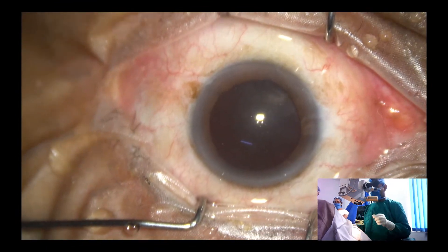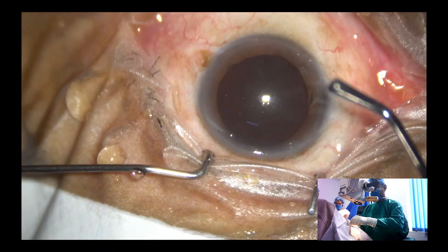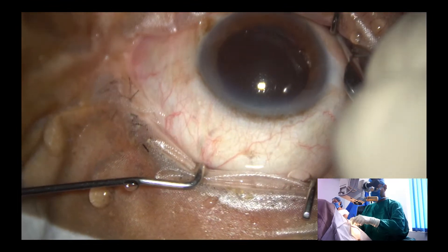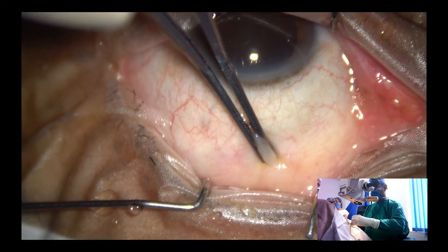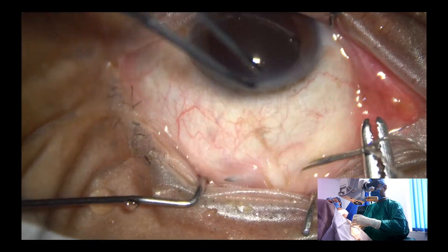First, I am going to apply a superior rectus bridle suture. The eyeball is turned down with the help of a muscle hook. The superior rectus tendon is held and the bridle suture is passed.